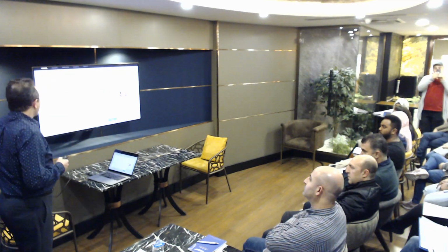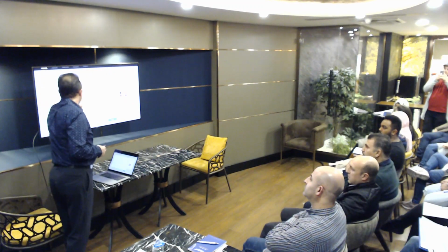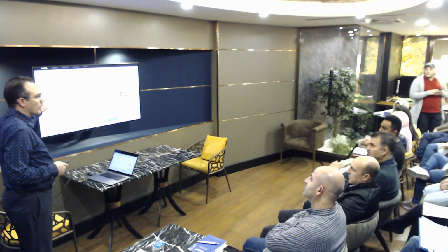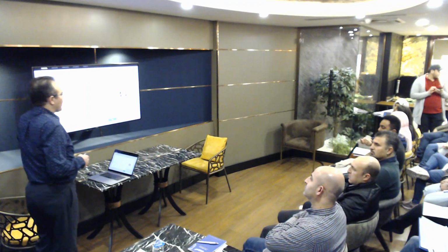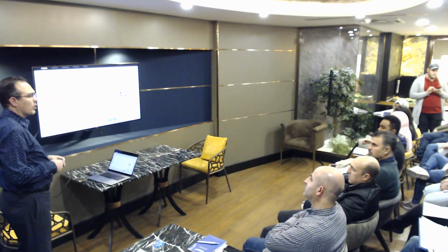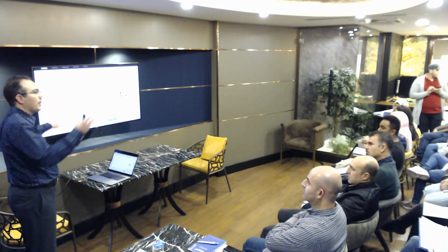So the first page is going to be which teeth you want to move and which teeth you don't want to move. Okay? You have all the teeth numbers here, upper and lower. If you choose none, you are giving freedom to the technician or whoever is working on the case to move all the teeth. If you have certain teeth that you don't want to move, then you check them now, so they will be blocked from being moved. Any ideas why you don't want to move teeth? Implants, for example, good.